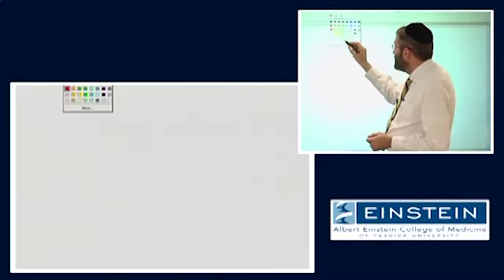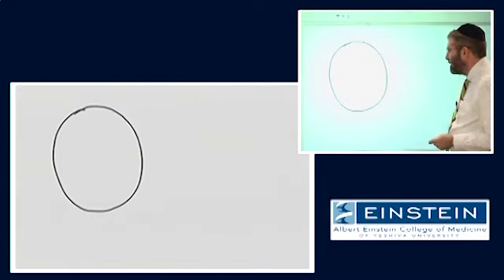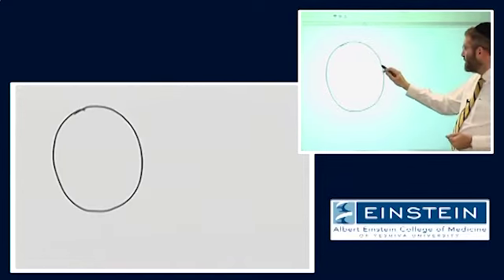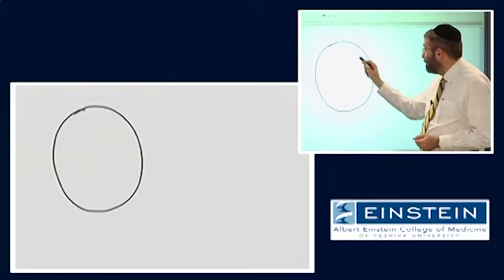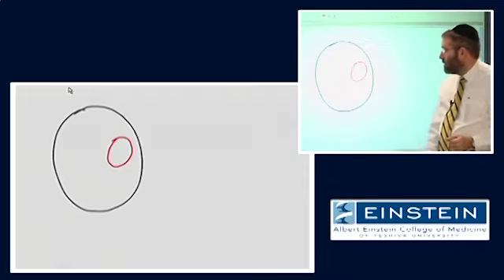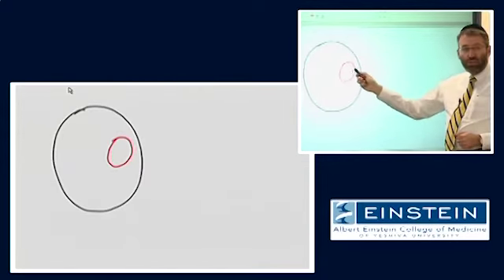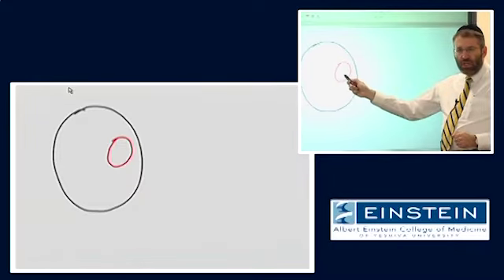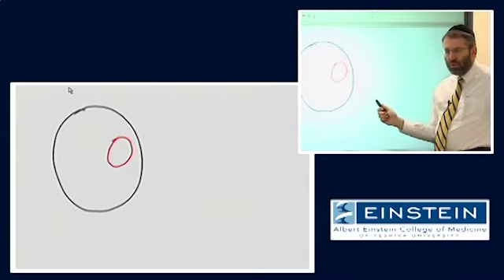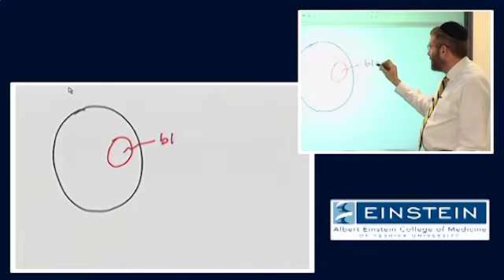Think about another example, right? If we have an image of the brain and there is an area of hemorrhage, so we are going to have signal loss in this location in the brain in proportion to the magnetic susceptibility of those blood products.